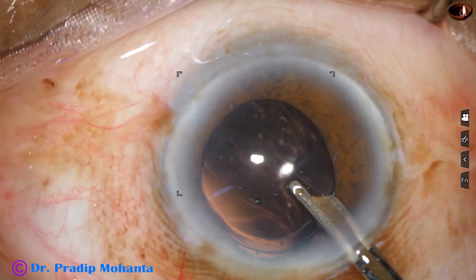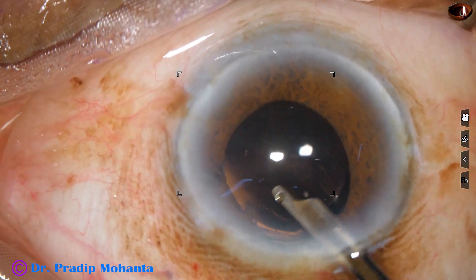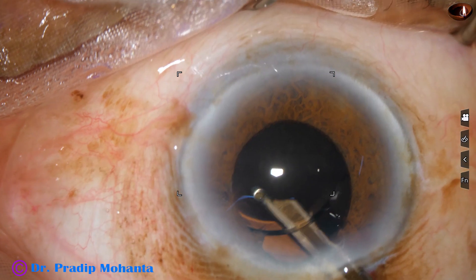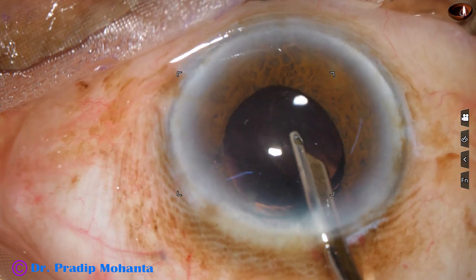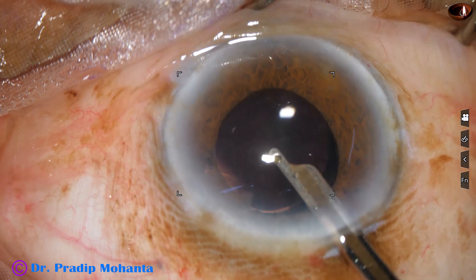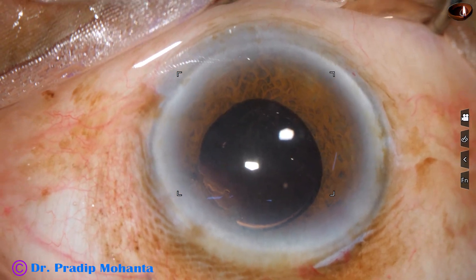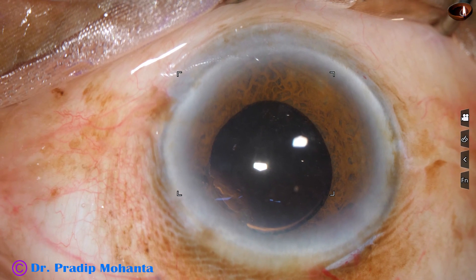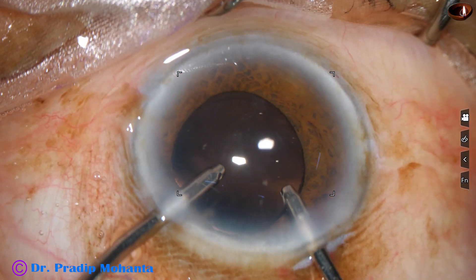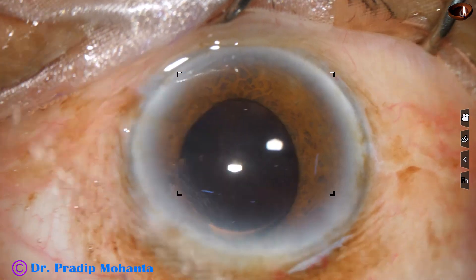Now our job is to remove the viscoelastic very nicely. First, I use the Simcoe cannula to decrease the load of visco from the anterior chamber and from the capsular bag. In such cases we must not leave visco behind the IOL, because retained viscoelastic is the main cause of postoperative visco-raised intraocular pressure and it causes a lot of discomfort to patients. Next, I use bimanual irrigation-aspiration to remove the visco from the anterior chamber.